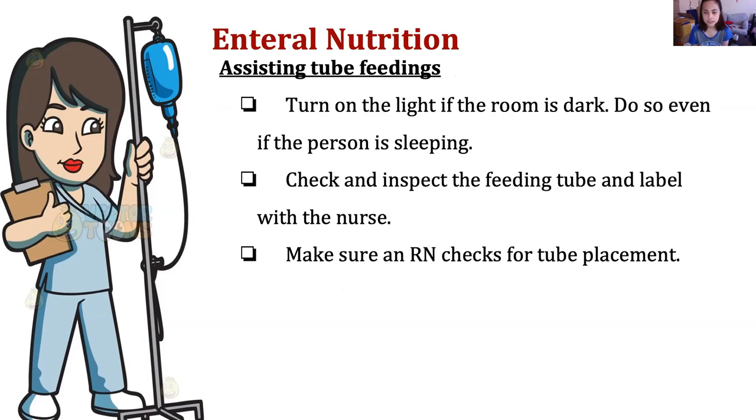Then check and inspect the feeding tube and label with the nurse. Always check the feeding tube. Maybe your patient has many tubes and we don't know which is the tube feeding, so you should always check. Anong tube ba ang para sa feeding?